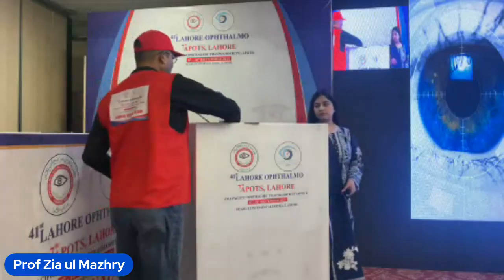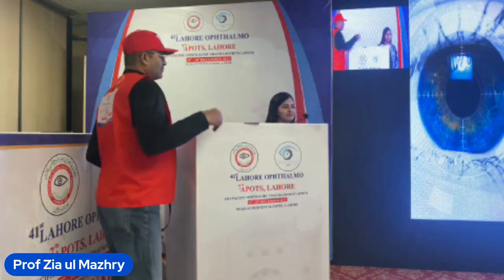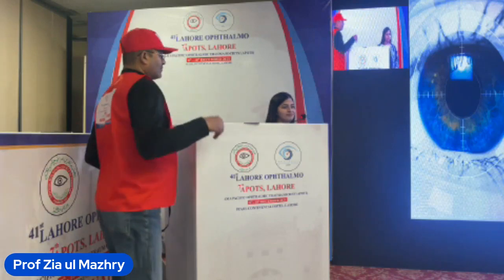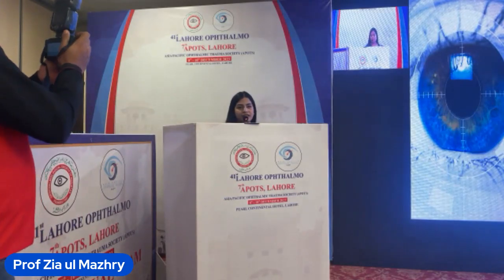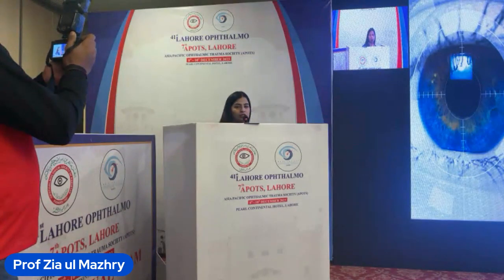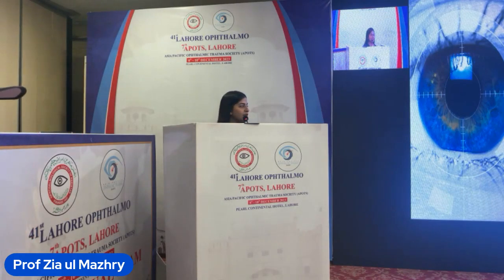Using optical coherence tomography. So the OCT saga continues. Please enjoy. Now. Bismillahirrahmanirrahim. Myself Sahri Shahid, and I'm from the College of Ophthalmology and Allied Vision Sciences. I have done this research project recently in the presence of Dr.